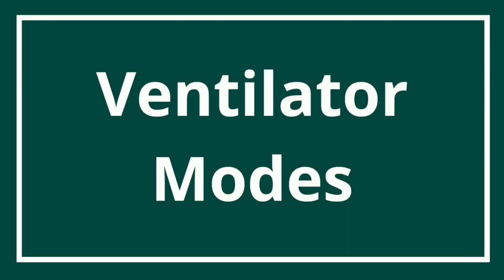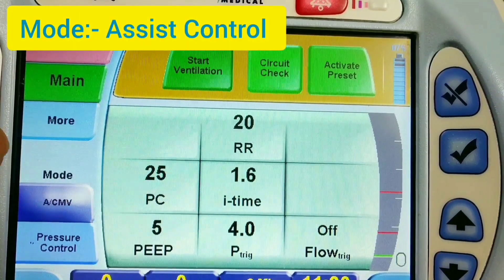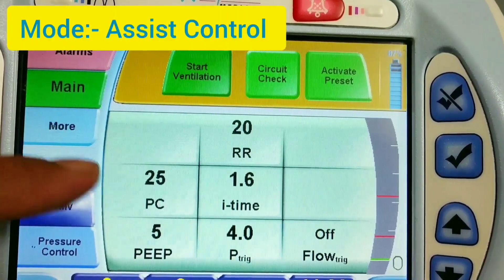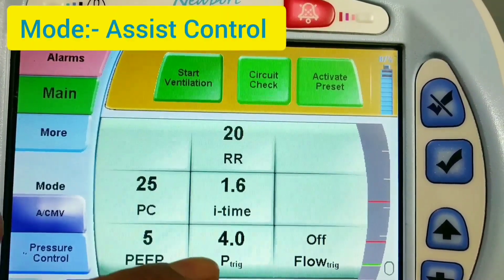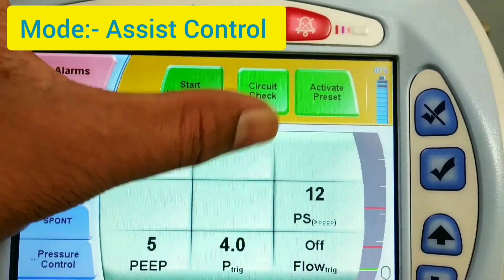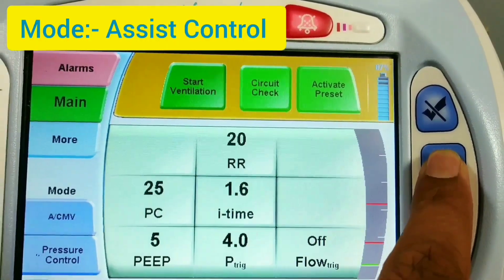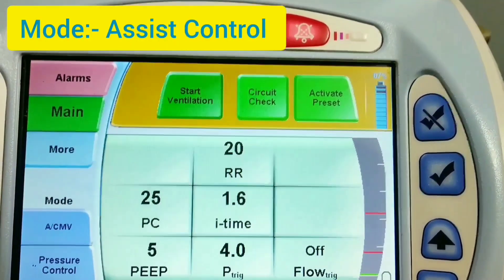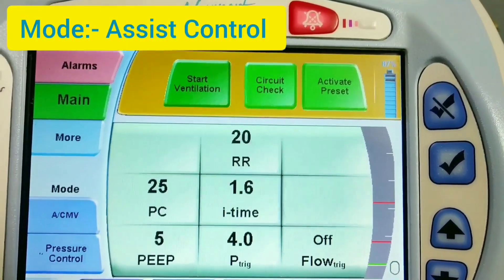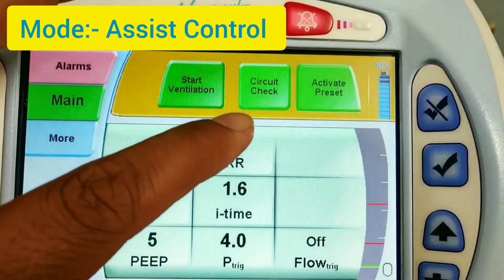Let's see the ventilator modes in the Newport HD70. Here the mode is Assist Control with breath type Pressure Control. The settings include pressure control level, PEEP, rate, inspiratory time (I-time), P-trigger, and flow trigger. You always have to tick mark the confirm button; otherwise it will revert to the previous setting. Only after pressing tick mark will the setting be saved.